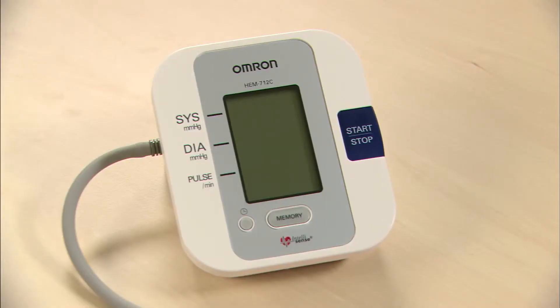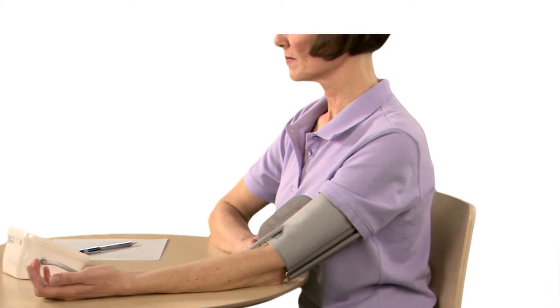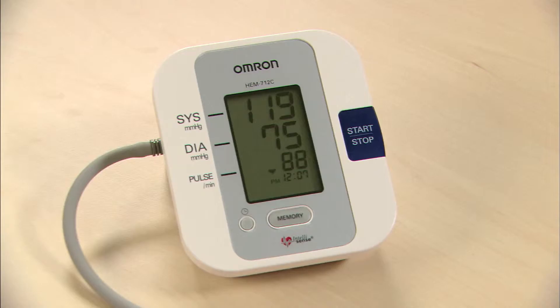To turn the unit on and take a measurement, press the start-stop button once. Sit straight and do not move during the measurement. The cuff will inflate automatically. Hold still until the cuff deflates and your results are displayed.